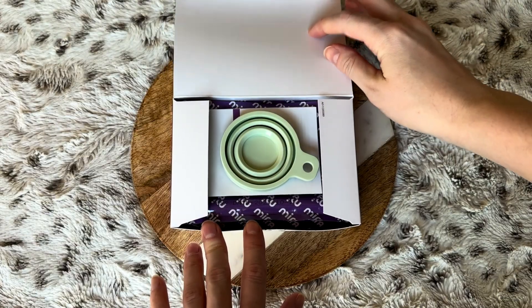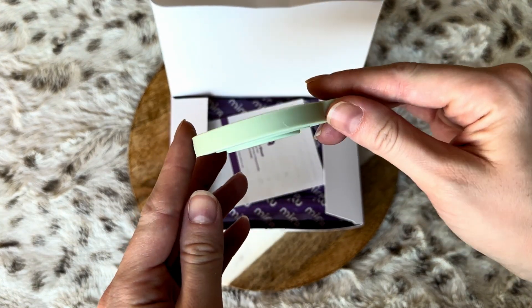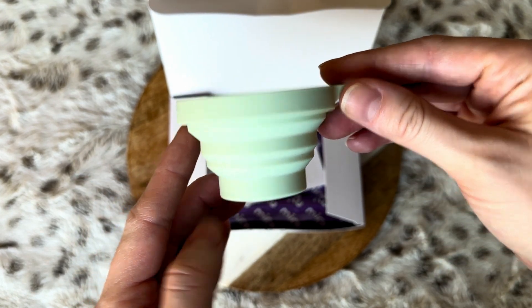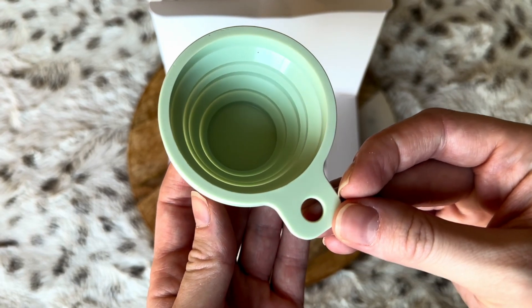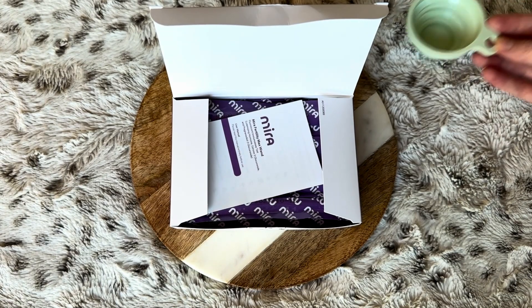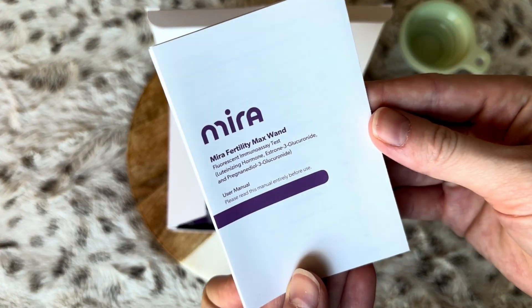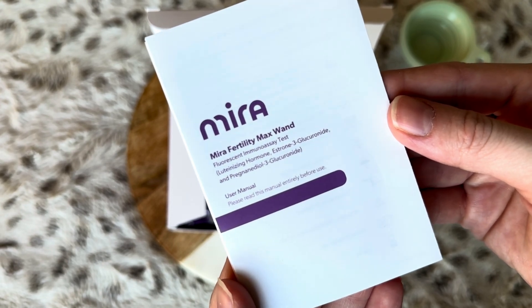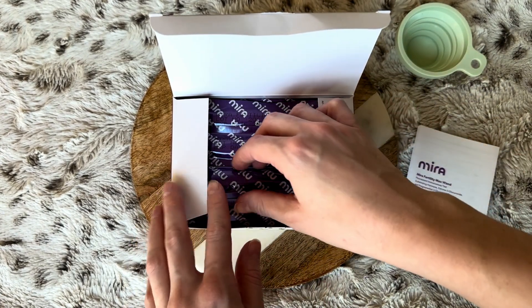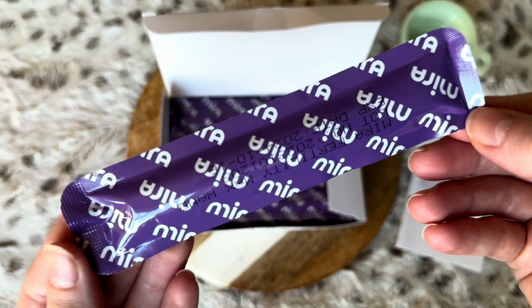Let me open the plus wands right here so I can show you what they look like. The wands come with a little cup to collect your sample in — this cute little green cup. They also include instruction manuals for whatever wands you're purchasing, how to set up the app, and here are the wands themselves.